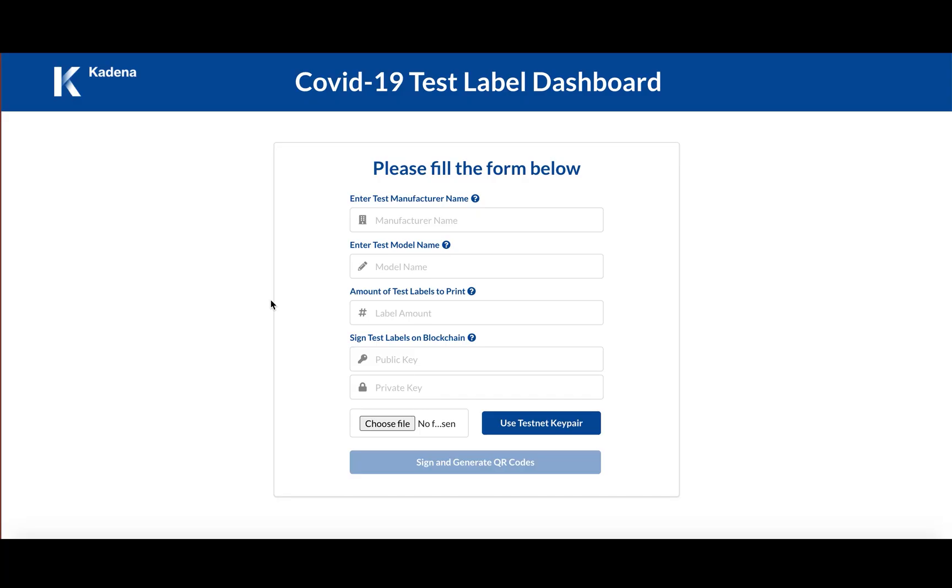Hi guys, I'm here today to walk you through Cadena's COVID-19 test tracking platform.